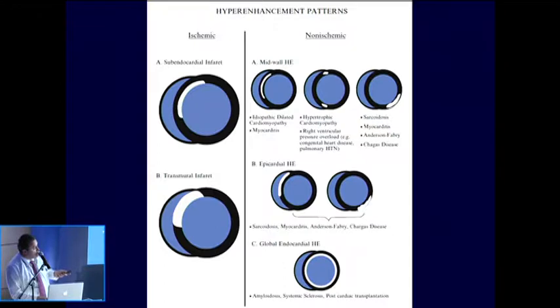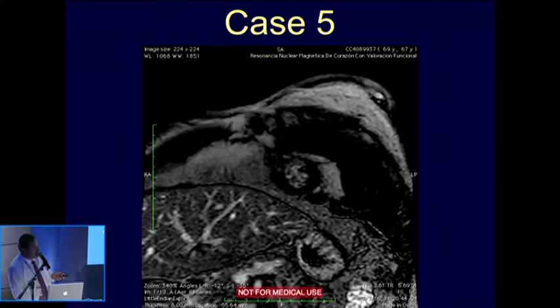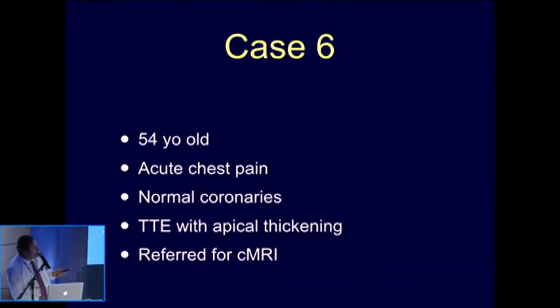This type of distribution may also be present in patients with right ventricle with increased arterial pressure. This was the description that Diego gave me once: dilatation of the right atrium, no increase in the thickness of the left ventricle, but we saw areas similar to these. And of course, this is not hypertrophic cardiomyopathy. This is increased pressure in the right ventricle, because in the areas of insertion of the ventricle, fibrosis pulls the septum, and that's why there is an increase in the late enhancement.